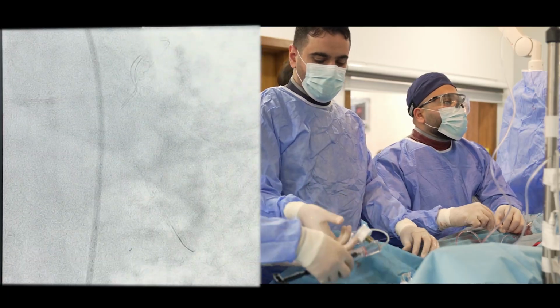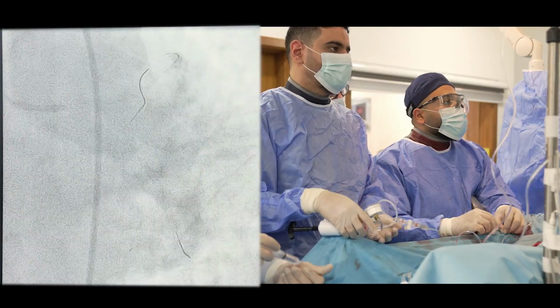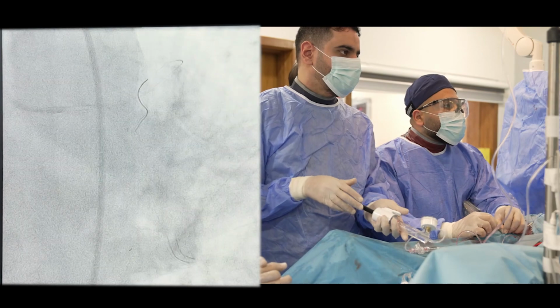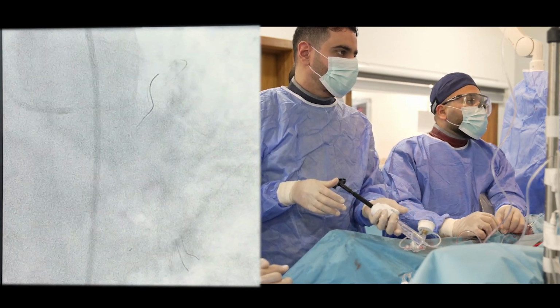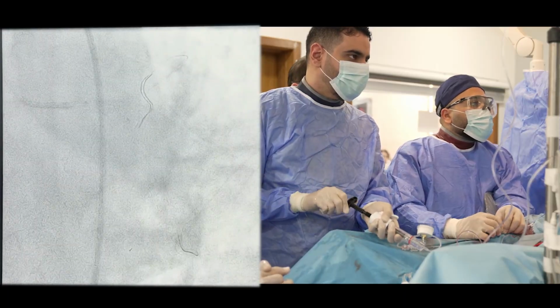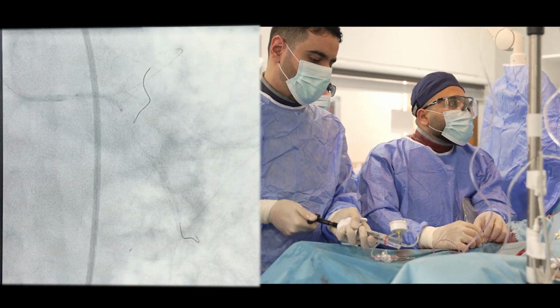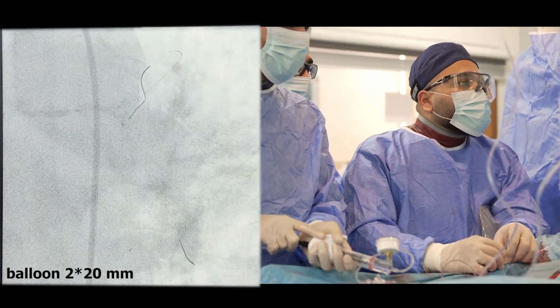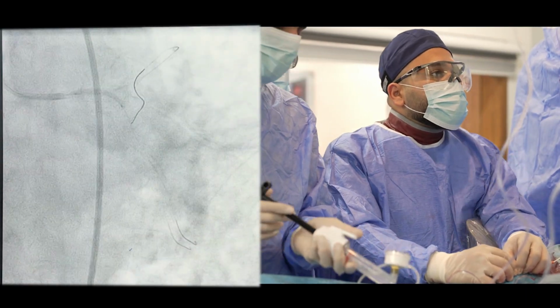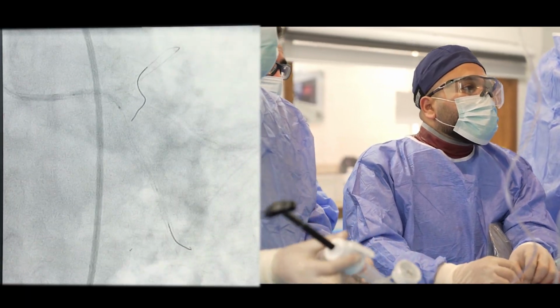Okay, let's see if a balloon 2 millimeter will pass. If not, we are going to take a smaller balloon, 1.5. I think it will go. Yeah, very good. That's it. Pull it back a little. Okay, inflate. No, 12. 12. 14. What is the burst? 20. Go 20. Off. Okay, take it out.